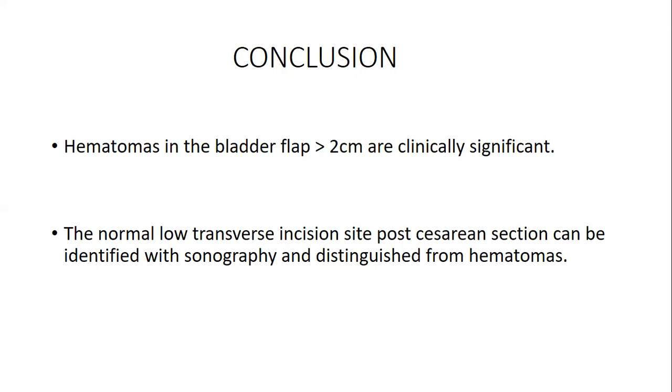By appropriate techniques, I mean we must also use the high frequency transducers to evaluate the superficial anterior abdominal wall incision site. We must also consider that we have to go deeper and evaluate the paracolic gutters, the retroperitoneal space, and also the peritoneal space. The whole idea is to correlate the clinical presentation of the patient and exactly what you are seeing on the sonography images.